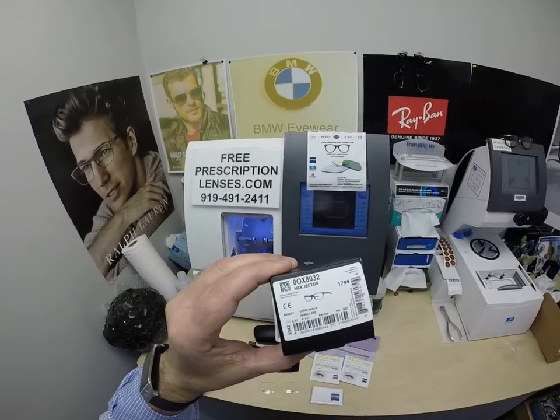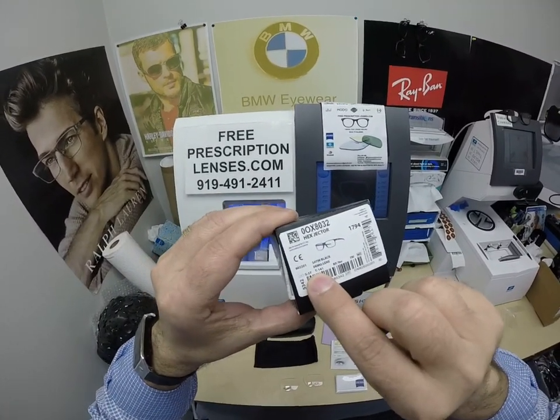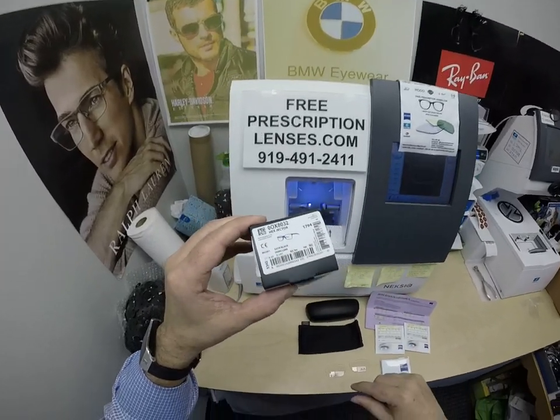That is the Hex Ejector, size 57, color 01, the satin black.